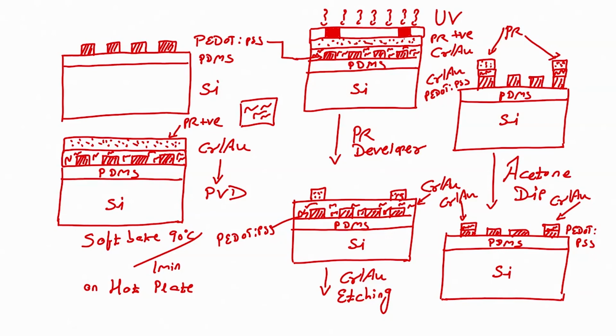Now, the next step would be to strip off PDMS from silicon. So, when we strip off PDMS from silicon, you will get this, right.